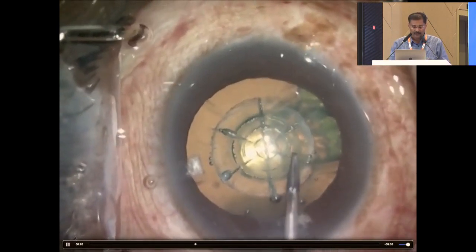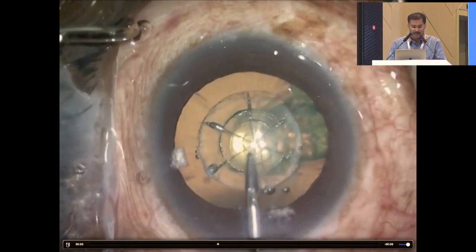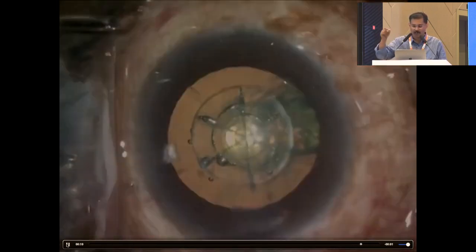After the capsulotomy, a nucleotomy is also done. This will generate gas inside, and you will lose the good red glow which you mostly see in your regular cases when you're doing a capsulorhexis. So identification of the rhexis margin, even if you have a lumera and good red glow, may still be a little difficult. I take it with very great caution and move it along as though you're doing a rhexis. Sometimes there may be skip areas, maybe because of the level, maybe because it didn't hit fully. Such areas should be included.